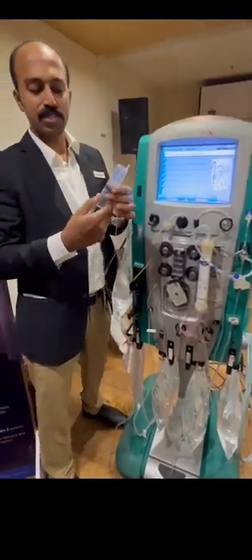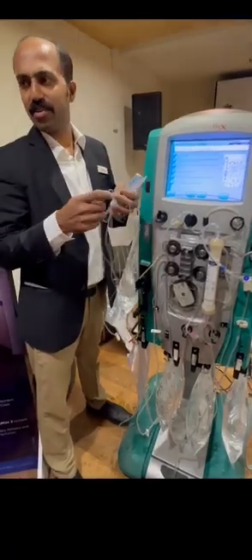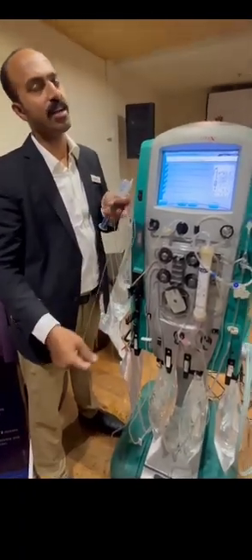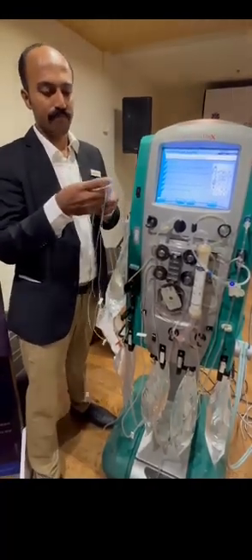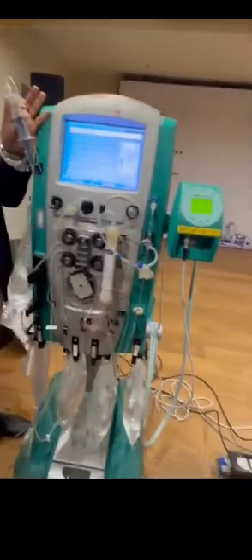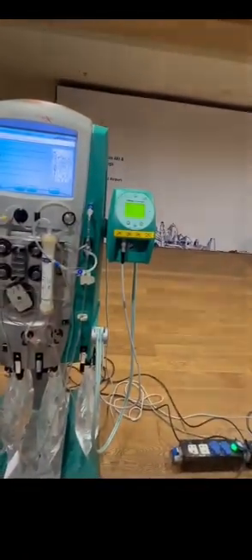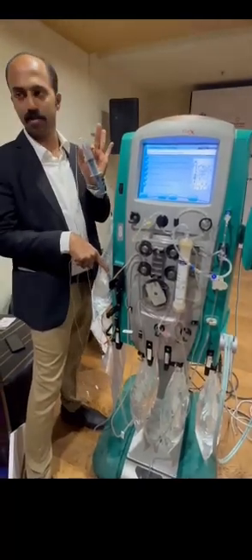So I will take calcium gluconate neat in this syringe, 50 ml. I think it is 10 ml per ampule, 10 ml only, so 5 ampules. Then I will connect this line. This is called CA250. This extra we need to purchase if you are using this machine for giving the calcium infusion.